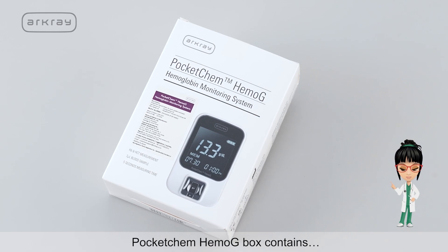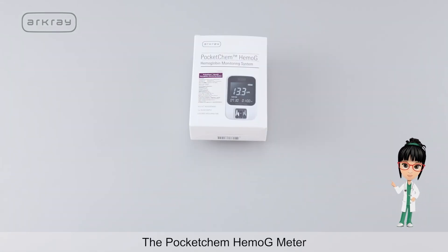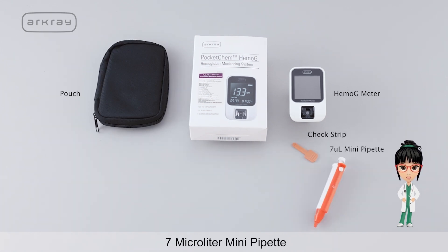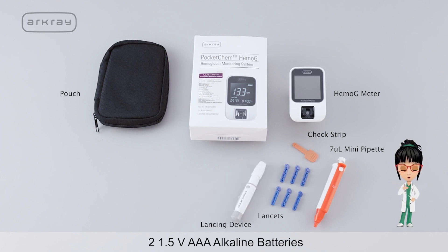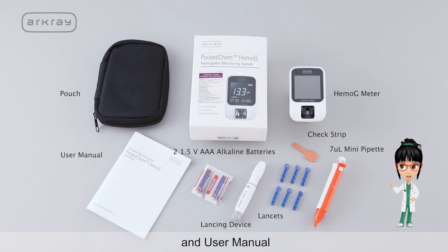PocketChem HemoG box contains: the PocketChem HemoG meter, pouch, check strip, 7 microlitre mini pipette, lancets, lancing device, 2 × 1.5V AAA alkaline batteries, and user manual.